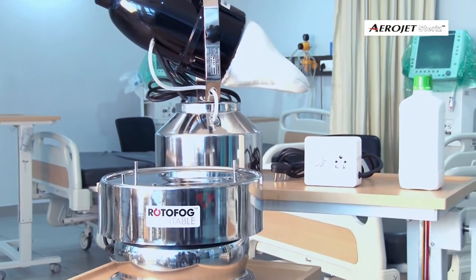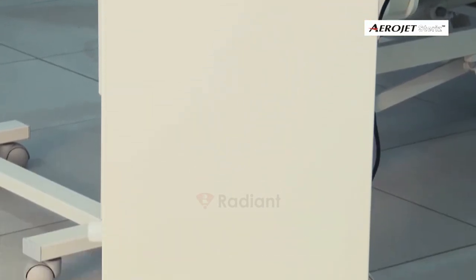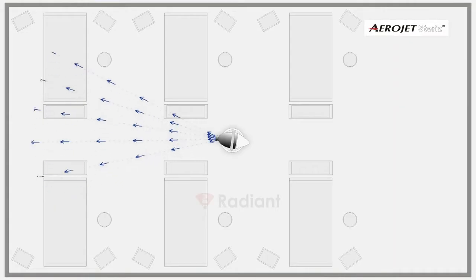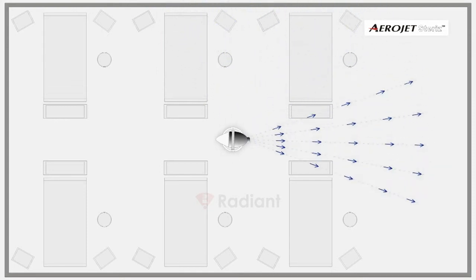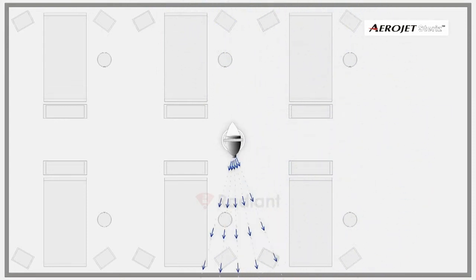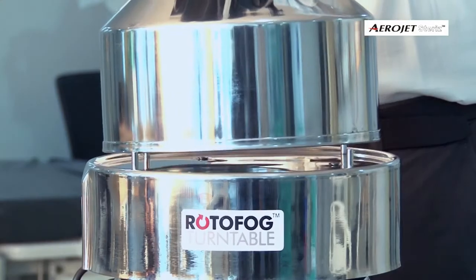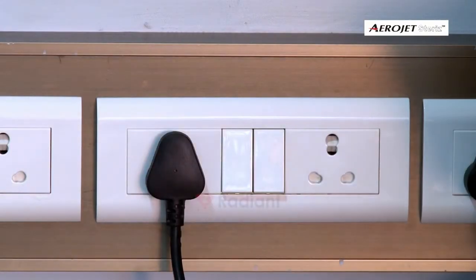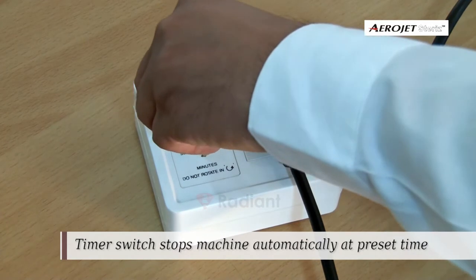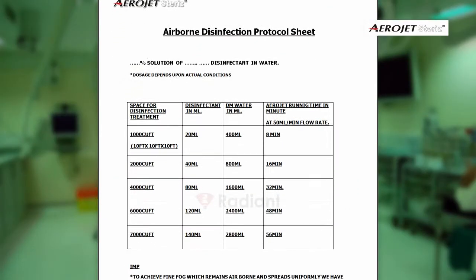If you are planning to use Rotor Fog with Aerojet, place the Rotor Fog on a steady table at three feet height, preferably in the center of the room. Place the Aerojet on it and make the necessary power connections. Set the time knob in a clockwise direction to a time value determined from the protocol sheet.